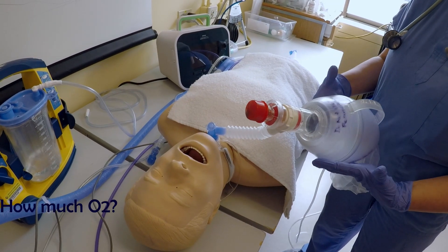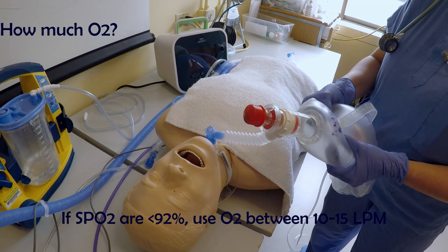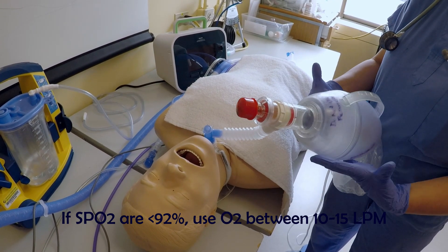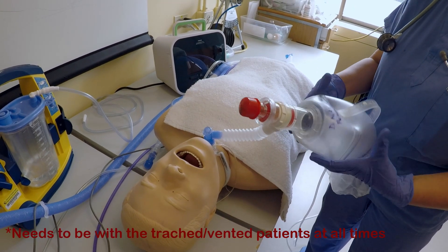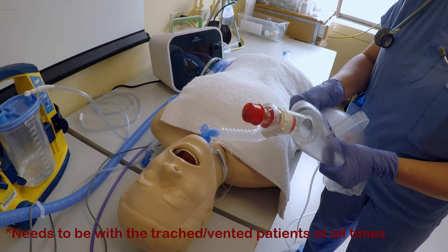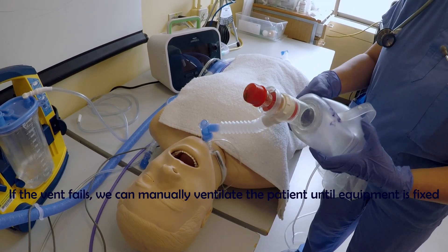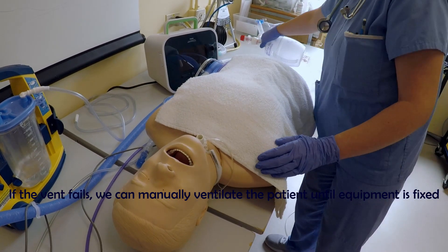How much O2? If oxygen saturation levels are below 92%, use O2 between 10 to 15 LPM. This is the most important piece of equipment that needs to be with the trach vented patients at all times. If the vent fails, we can manually ventilate the patient until the equipment is fixed.